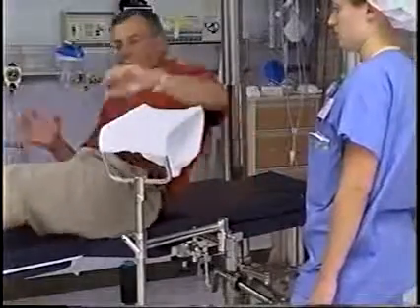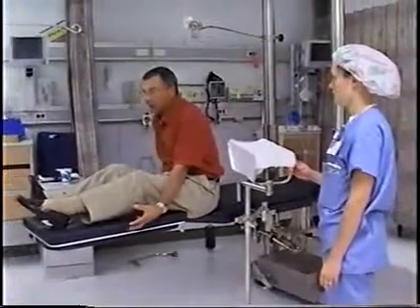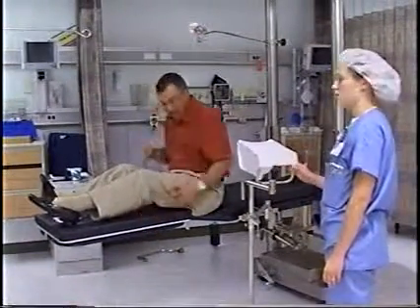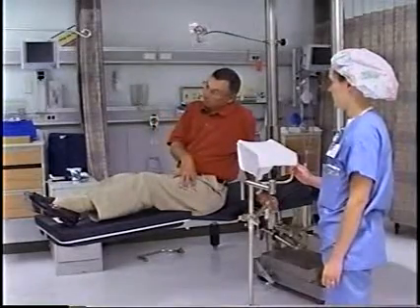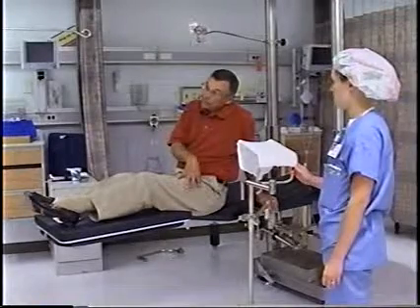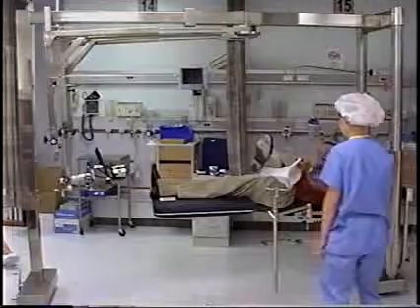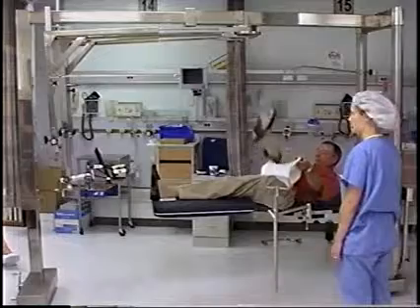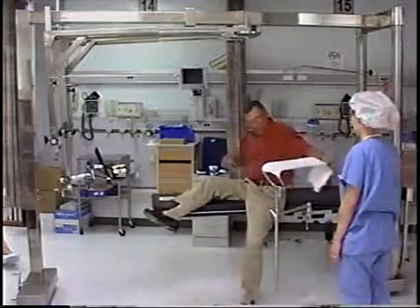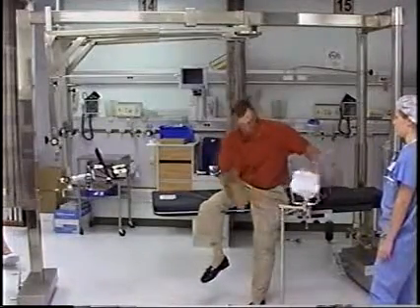The thing that you have to remember is you want to get it as far away from the operative side as you can so radiology can get a C-arm in. Because remember, if the doc is doing a high femoral break, he's going to have to come straight across here. So he might abduct that well leg way out of the way. It's not going to hurt the patient. She's asleep, or he's asleep. That's why it's called an articulating bracket. So it'll go in all kinds of different directions.